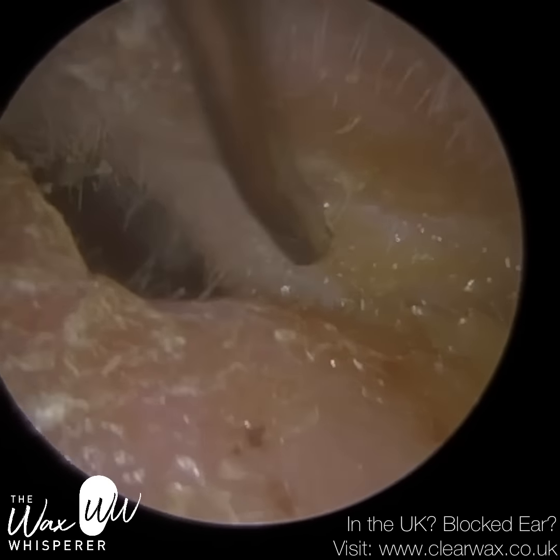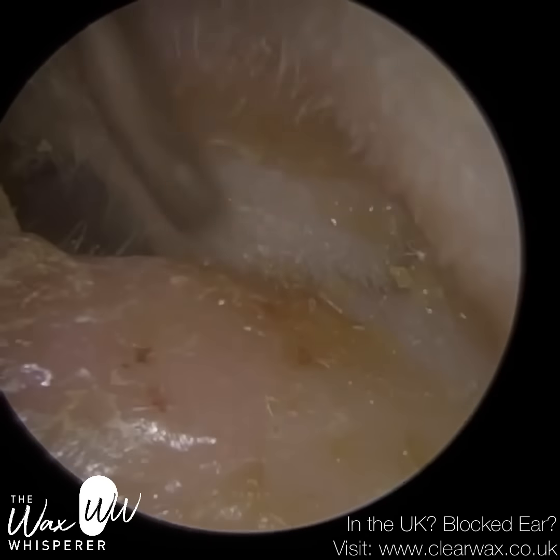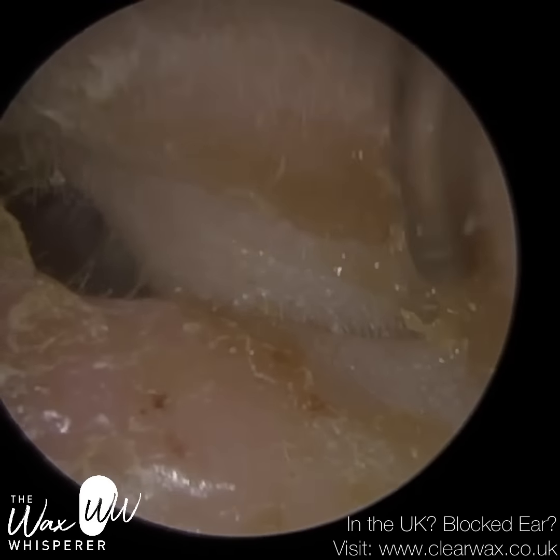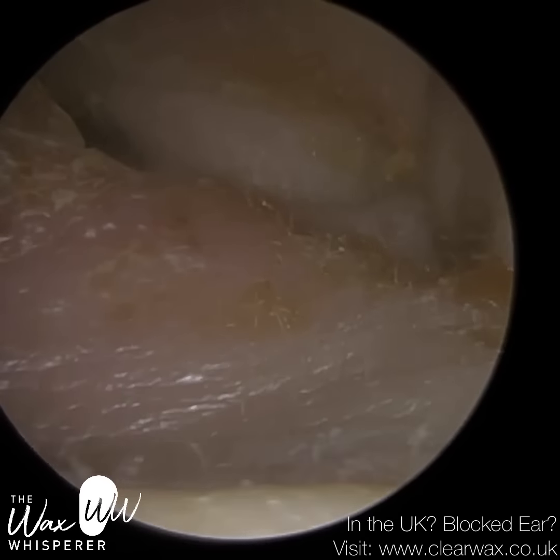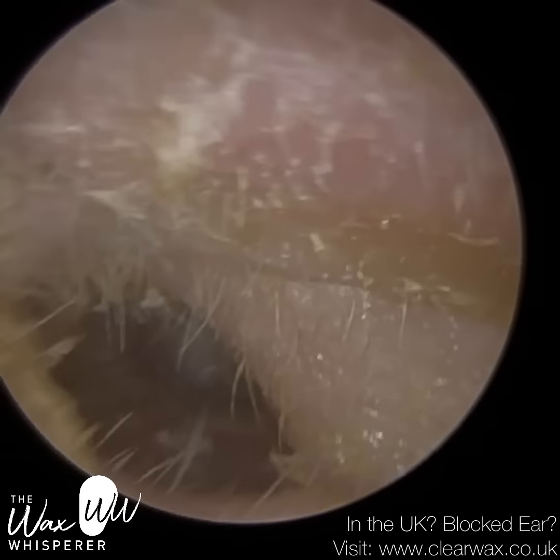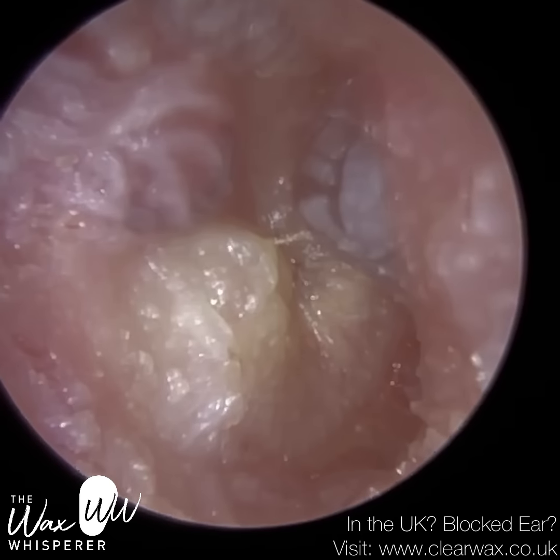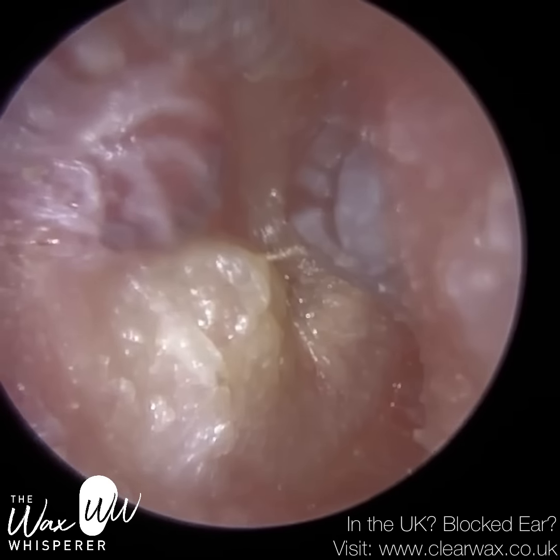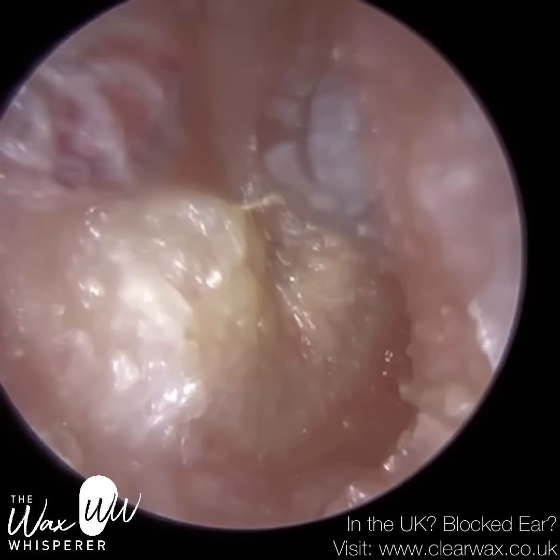So we've written to the patient's doctor already. In the meanwhile, whilst they're waiting for an appointment and prescribed medication, they're going to use some over-the-counter treatments to try and avoid this eardrum from exploding or imploding, should I say. And again, you can just have a final look, and we're going to see that fluid behind the ear. You can really see that beating away, and you've got a bulge at 10 o'clock and also at 3 o'clock.